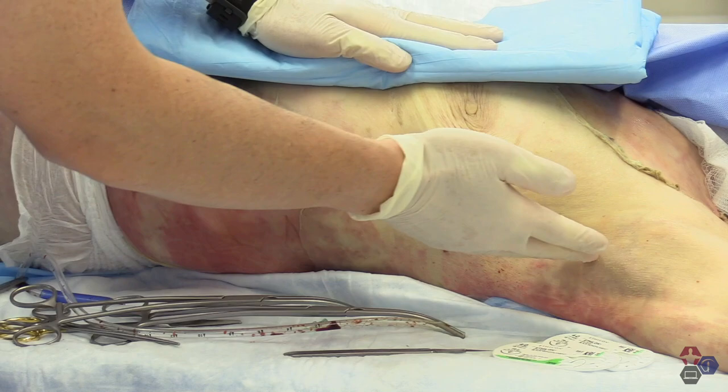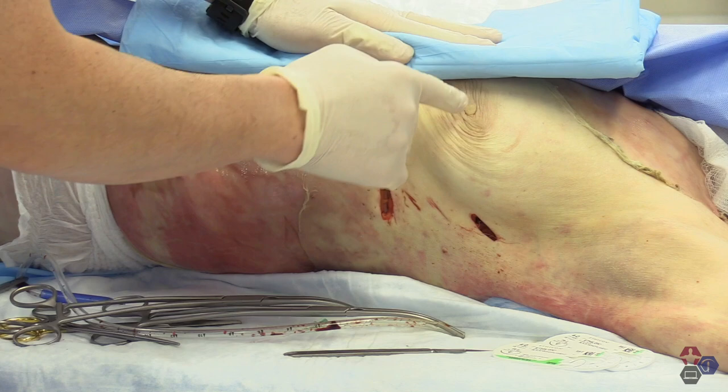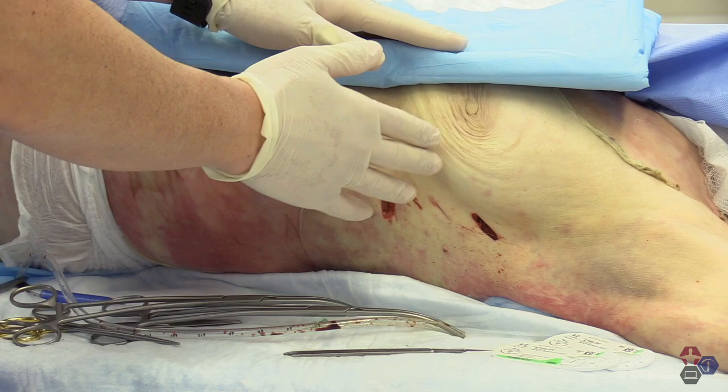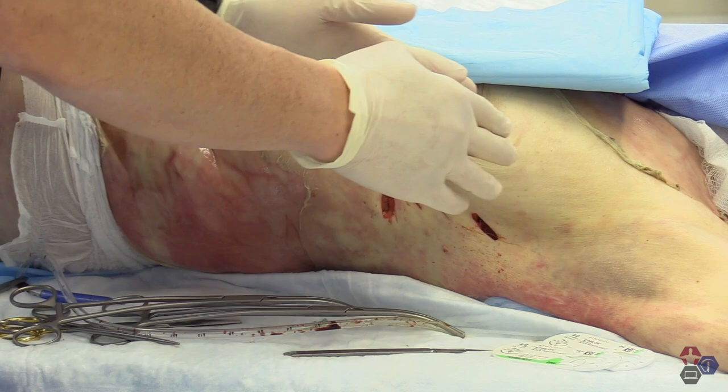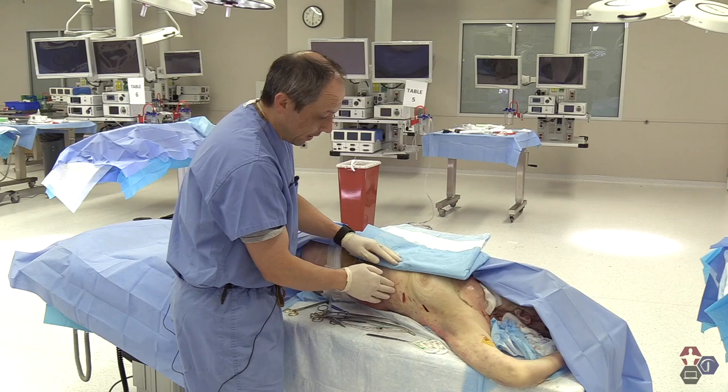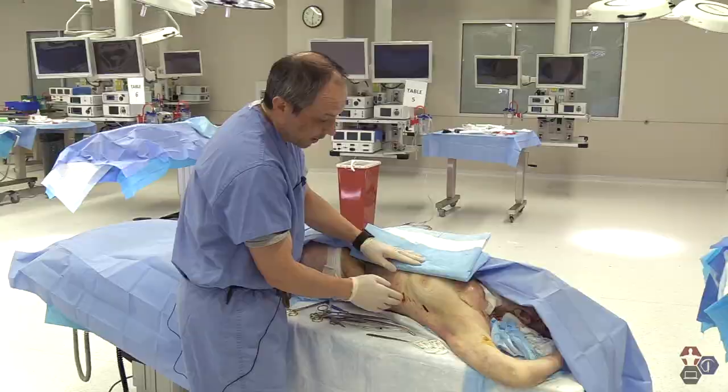Let's look at the anatomical landmarks before we start. Here you notice you have the mid-axillary line, here is the anterior axillary line, here is the nipple. Typically the nipple corresponds with rib 4 or 5. Now in people with different anatomical structures or previous surgery, that nipple landmark may change slightly, so it could be lower or higher. If in doubt, always go a little higher to avoid hitting anything into the abdominal cavity.